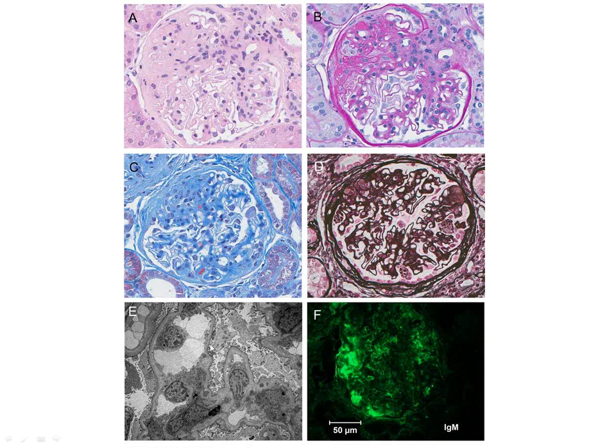Panel E? Oh, so that's all podocyte. So the question was, what is all this material here in the urinary space?